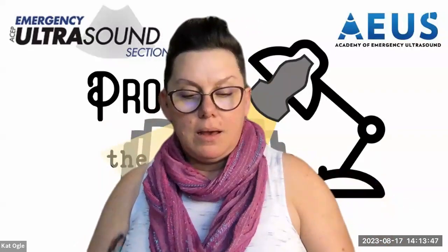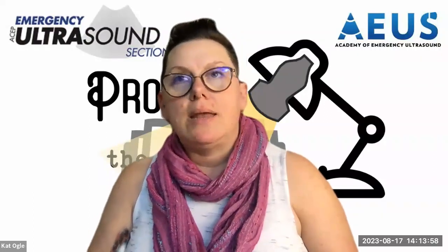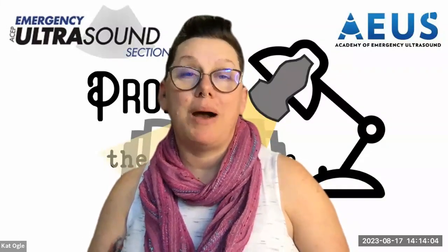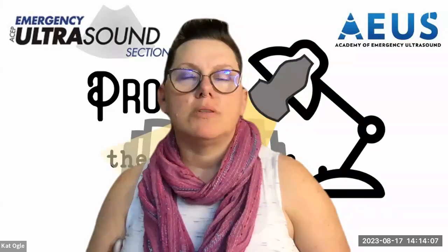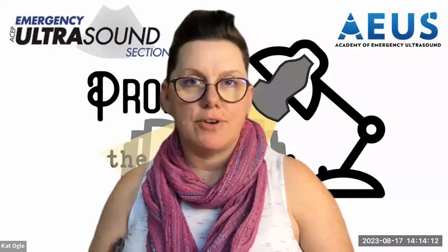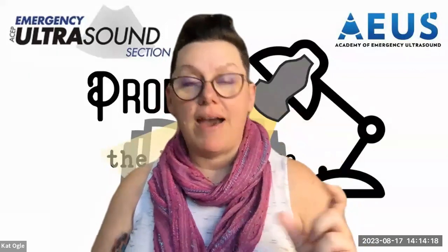On the good side, we found that we're pretty darn good at pulling together negative FAST exams. So your true negatives and your true positives, we're pretty good at that. And when we looked at reasons for exams being false positives, they were small things like a resident misinterpreting the pericardial fat pad, for example, as a pericardial effusion, or looking at the perinephric fat that is adjacent to the kidney and the spleen, or the kidney and the liver, and then thinking that that hypoechoic area of adipose was actually free fluid.